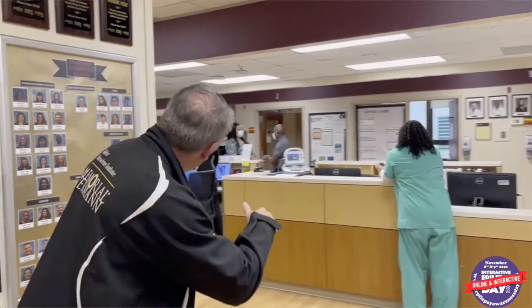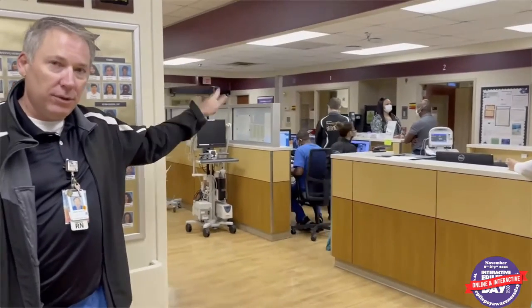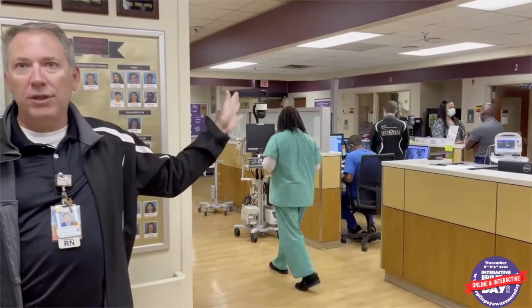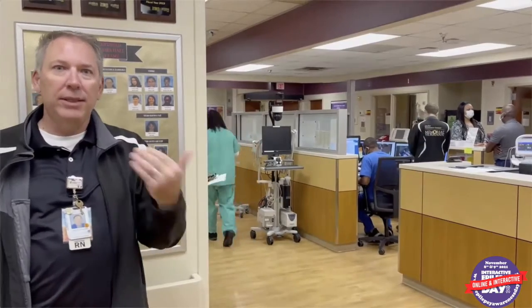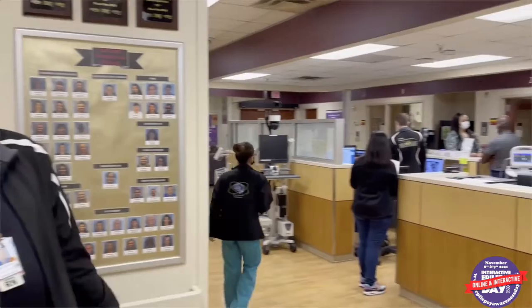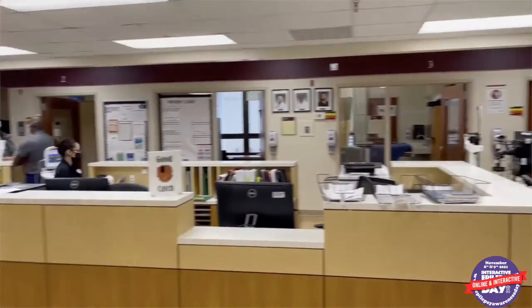Right over here, we have the monitoring station. This is for the nurses to be looking at the patient's condition live, because we can see the clinical aspect of the seizure while the technicians will look at the visual, audio, and also the EEG aspect of the seizure. So 5 of these rooms, they're all monitored. You come in on a specific day.